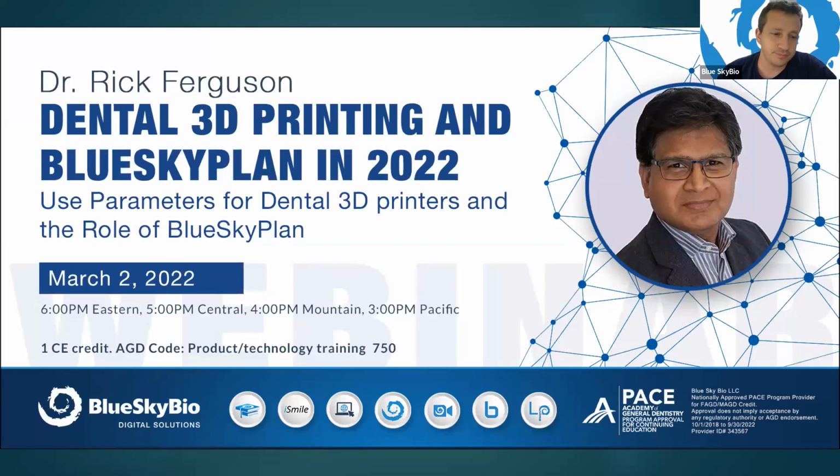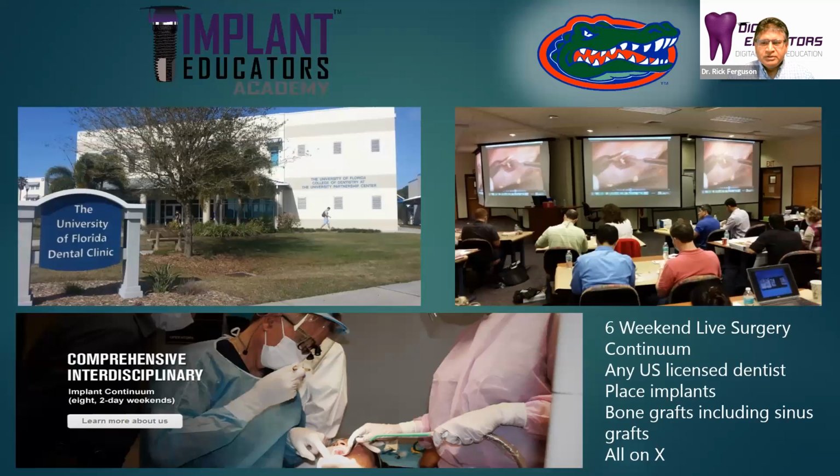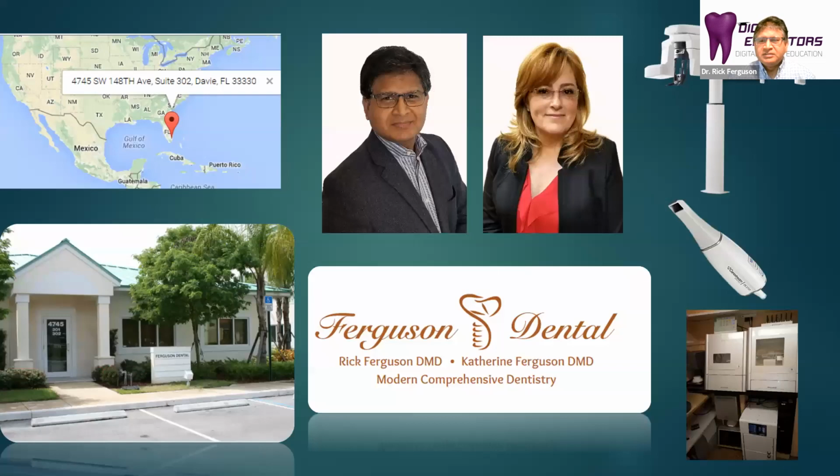Thank you, Michael. And let me say, first of all, it is my honor to be here. Thanks for inviting me back because I'm always excited to present on BlueSkyPlan. BlueSkyPlan is the foundation for what we do in all of our courses now, not just our digital courses, but also our implant training courses. We have adopted it into our implant continuum, and you'll get a chance to see actually a case we did recently. But you know, as you mentioned, we do have courses that we teach implantology and of course, digital dentistry.